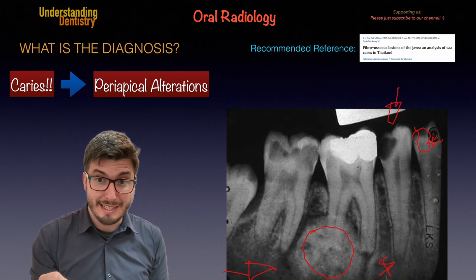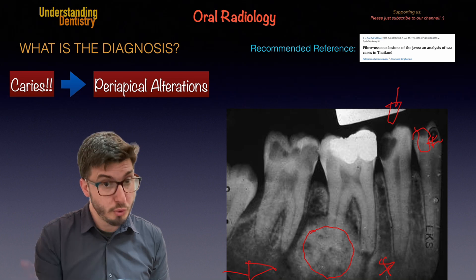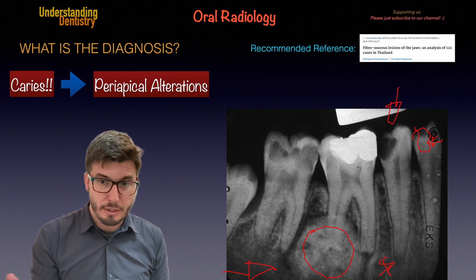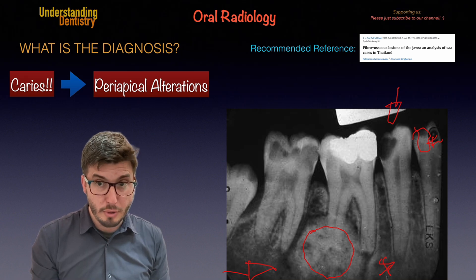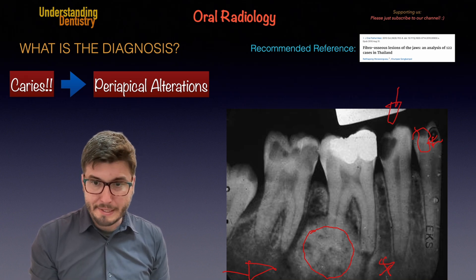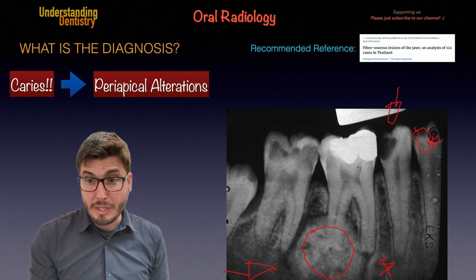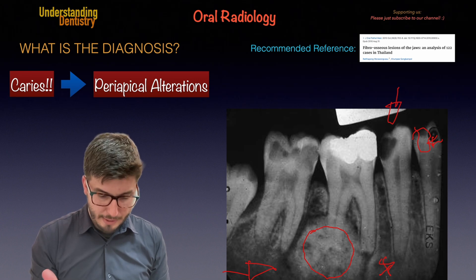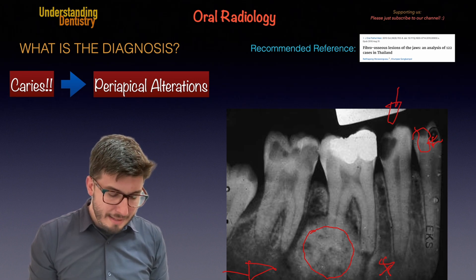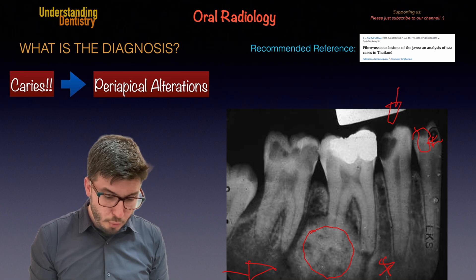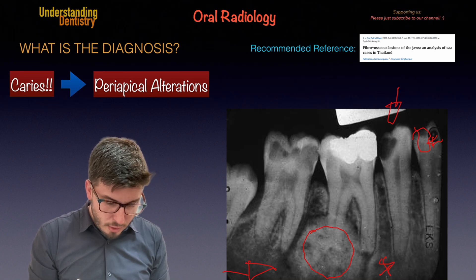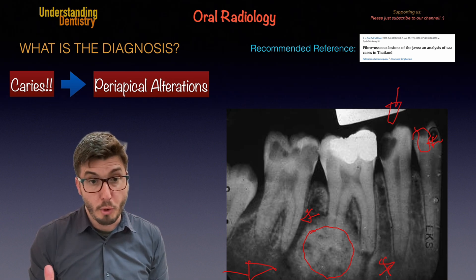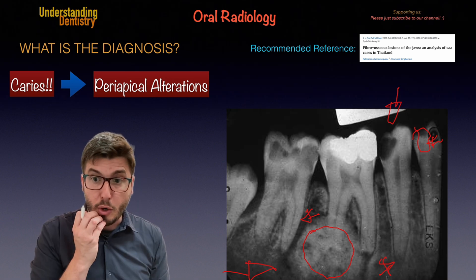Don't forget to mention that this lesion is superimposed on the roots. So now we cannot see the lamina dura, the periodontal ligament space, or the rest of the shape of the distal root of this first molar. The lesion is symmetric and round. We might also have a little bit of root resorption, and this is also causing resorption of the lamina dura of the mesial root of the second molar.